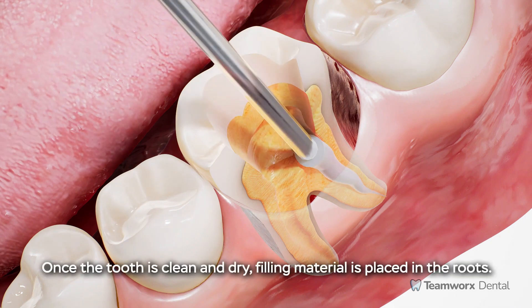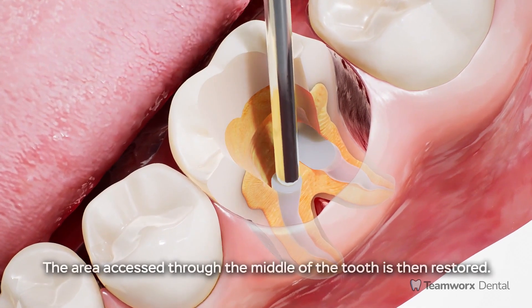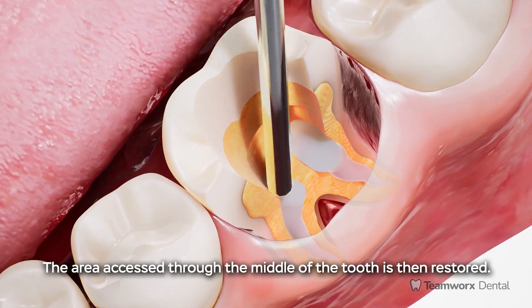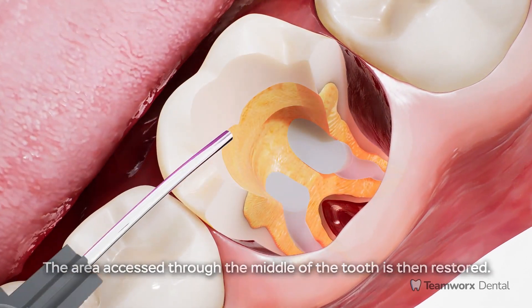Once the tooth is clean and dry, filling material is placed in the roots. The area accessed through the middle of the tooth is then restored.